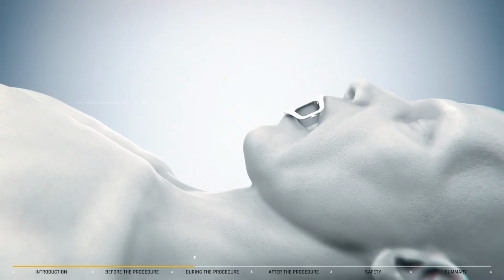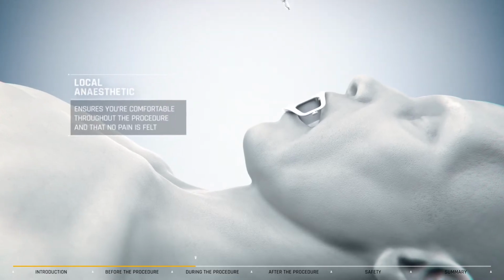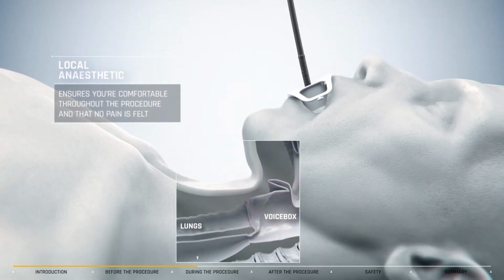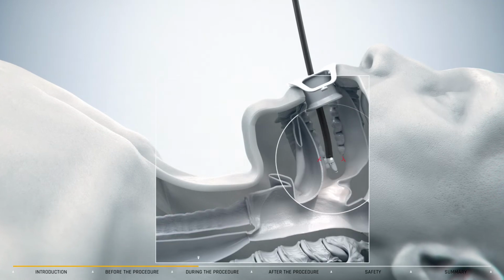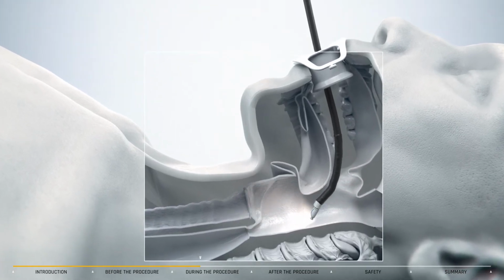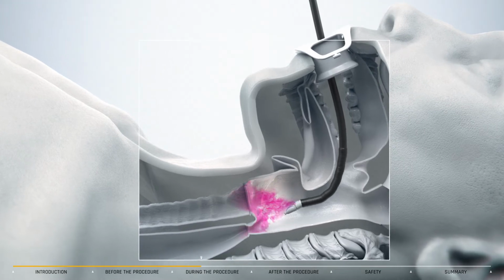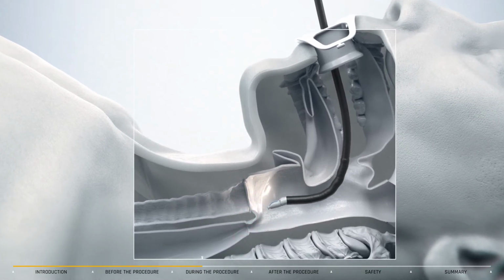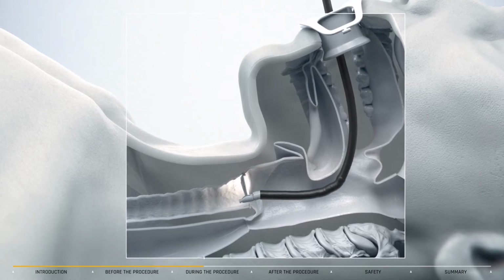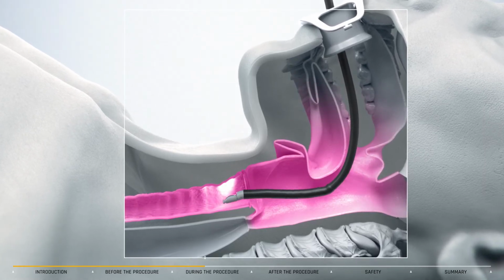When you are lying comfortably and sedated or asleep, the EBUS scope is placed in the mouth, past the voice box, and into the lungs. As the tube is introduced in the throat, voice box, and lungs, the area is sprayed with local anesthetic. You may feel some discomfort as the bronchoscope is passed through your voice box. This will pass when the local anesthetic takes effect.